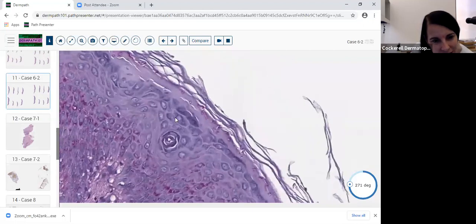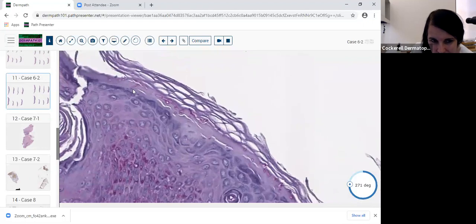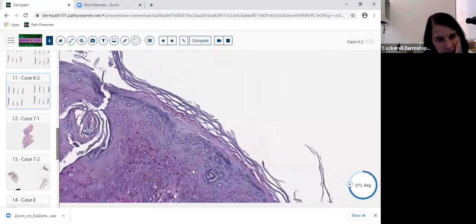Now, don't go off the rails and think this is tinea versicolor because you see a couple of these hyphae cut in cross section. Don't do that. You know, the meatballs and spaghetti. Tinea versicolor, you'll see more spores. And Candida, you'll see spores, but the spores will be bigger. They'll be 6 micron spores. So you have to see bigger spores for Candida, and you have to see the hyphae going vertically, not staying horizontally or parallel to the epidermis. So this is not Candida. This is just plain old tinea.